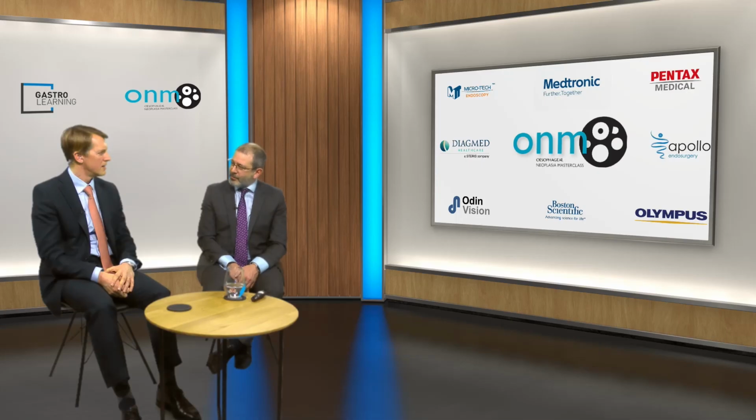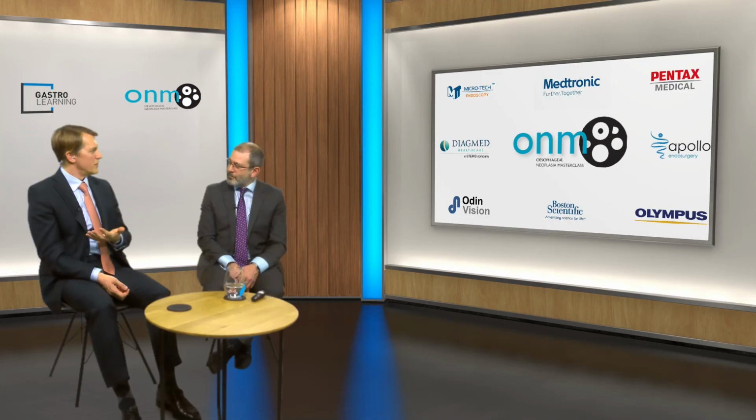We've had some experiences with biodegradable stents as well. What are your views on using those as opposed to fully covered metal stents when providing therapy? Well, the advantage, of course, is once you put them in, you then don't have to remove them. And we know from some of the randomized studies which we were involved in with a range of different types of strictures, that they certainly reduce the number of dilatations required in those with refractory strictures, for example.